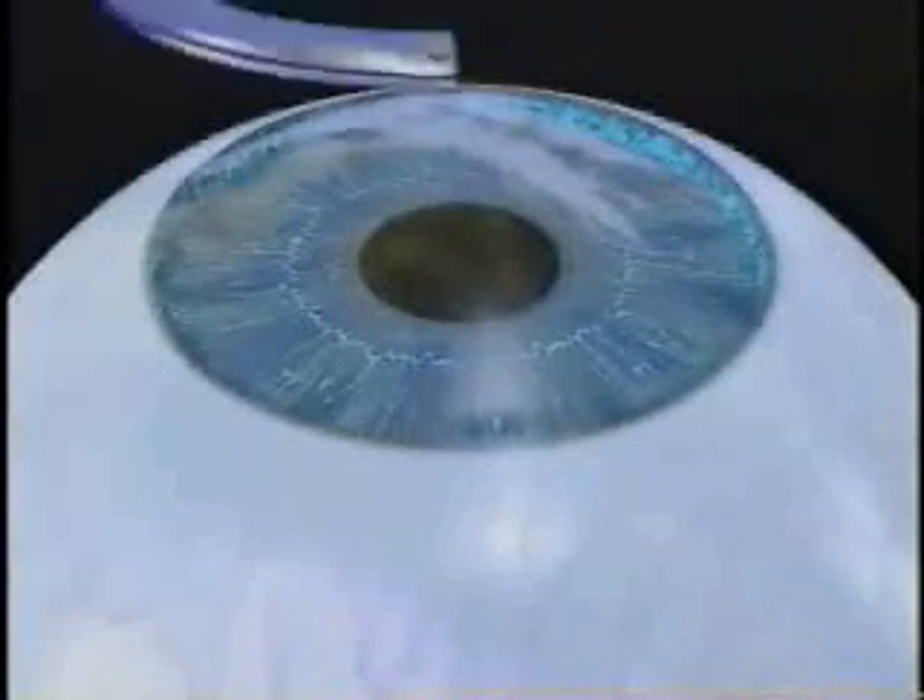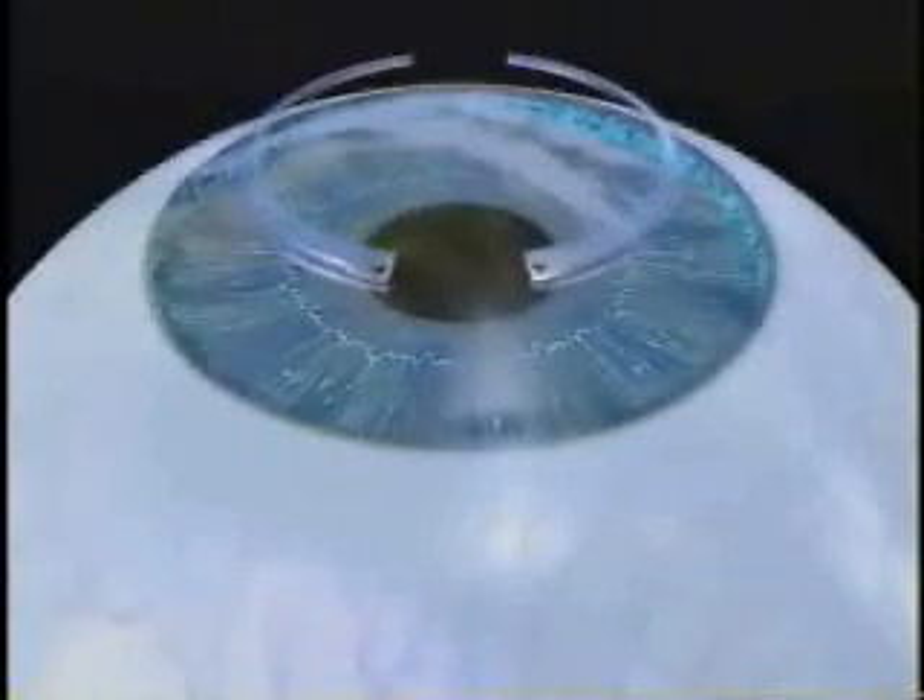Two semicircular micro thin segments are placed within the cornea but outside of the central optical zone. They are placed through a tiny opening less than two millimeters wide. The ring is gently inserted into the opening, resting between the natural layers of the cornea. The procedure takes about 15 minutes.